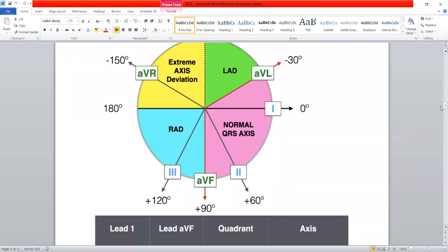The normal cardiac axis is directed downward and towards the left, because the direction of the flow of the current is downward and towards the left. So if the direction of the flow of the current changes, the cardiac axis also changes accordingly.